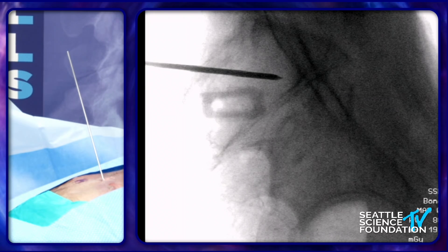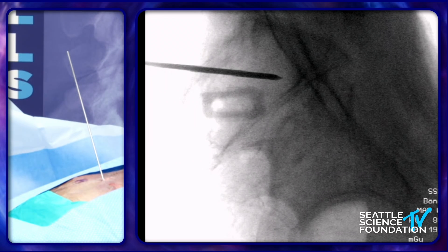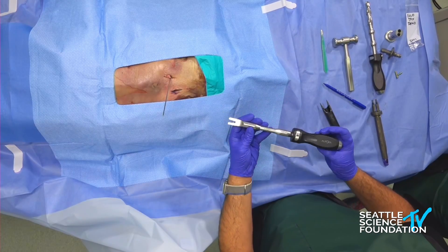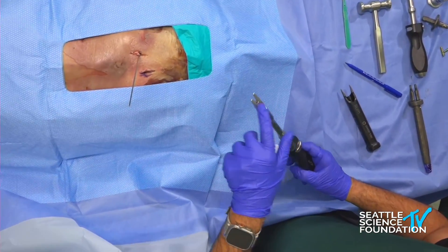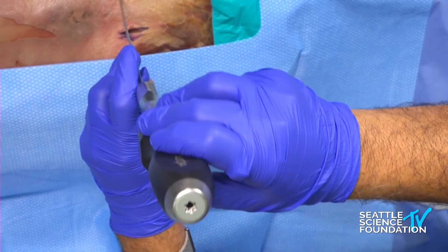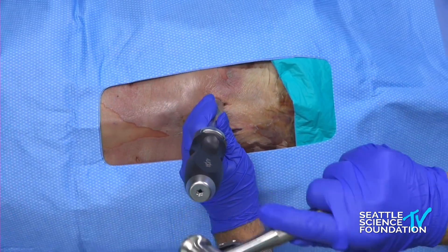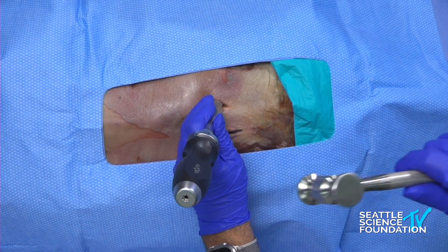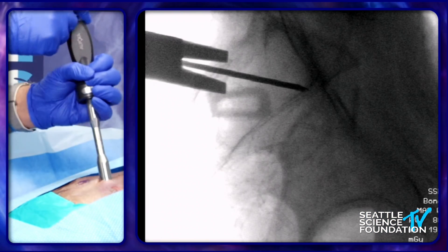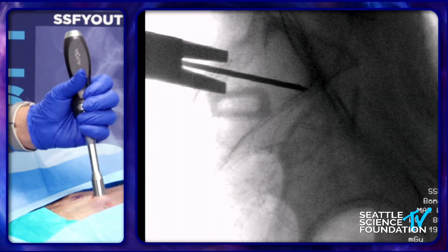The first step: you put the Steinman pin in and get into the joint. The next step is the joint finder. The bigger aperture is for the ileum side; the shorter one is for the sacrum side. You basically mallet it in.